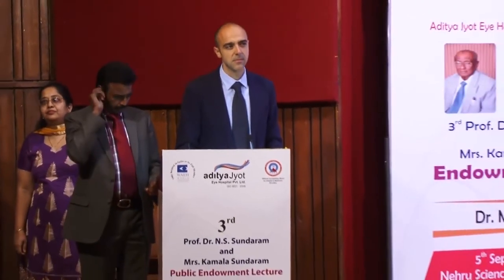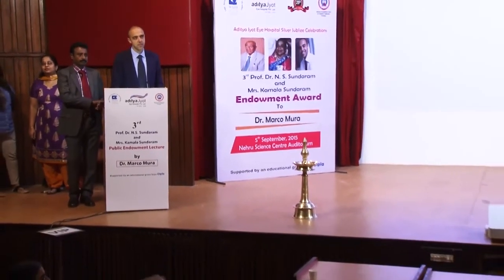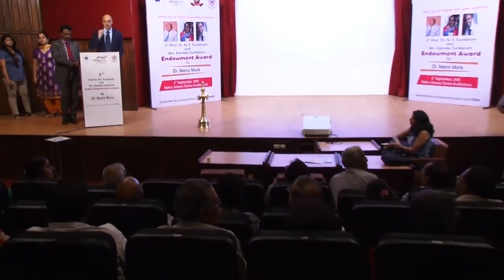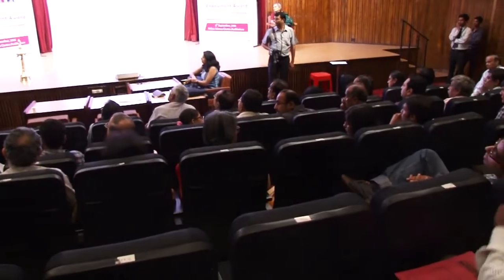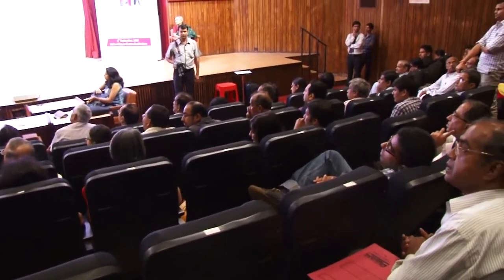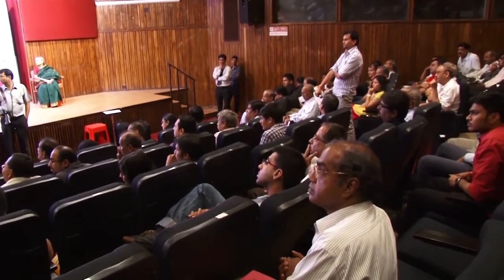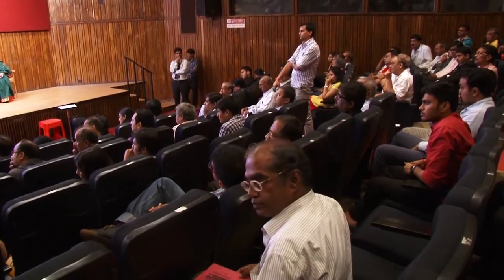Doctor, my son is a patient of ROP, retinopathy of prematurity. Of course, this device does not cover it, but are there any chances of any other diseases being covered by Argus 2? There is a chance for all the diseases, as I said, with degeneration of photoreceptors. Actually, Argus stimulates the retina when the photoreceptors cannot. So all the diseases that have that problem can be treated with Argus, in theory.